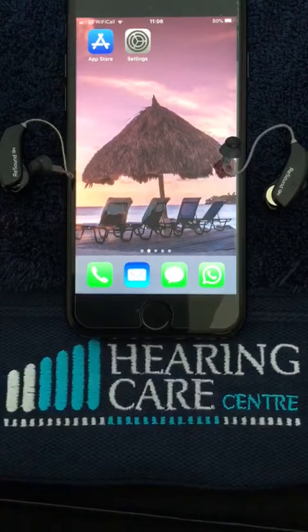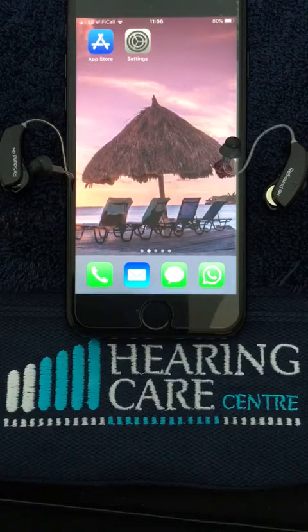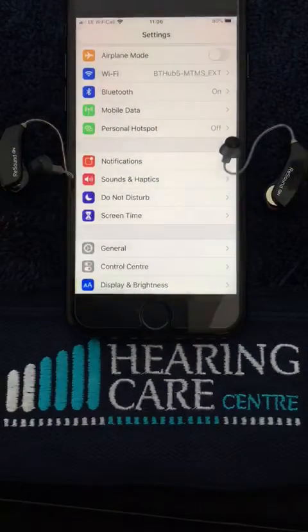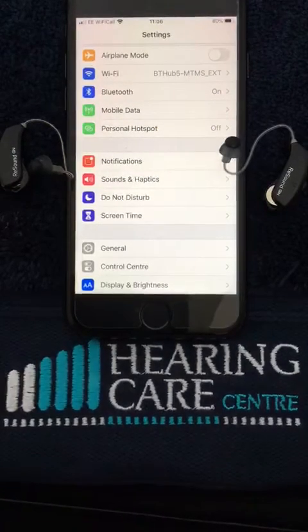There are other hearing aids within the ReSound range that have this facility, so please check with your hearing care provider or indeed the ReSound website to check compatibility. The first thing we need to do is check that our Bluetooth is on, and you can see on my phone Bluetooth is switched on.